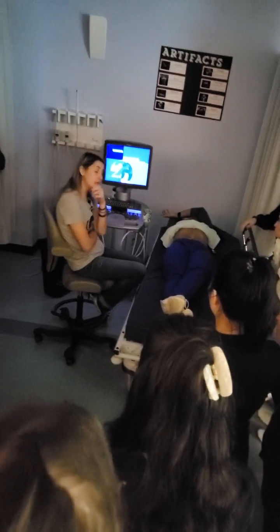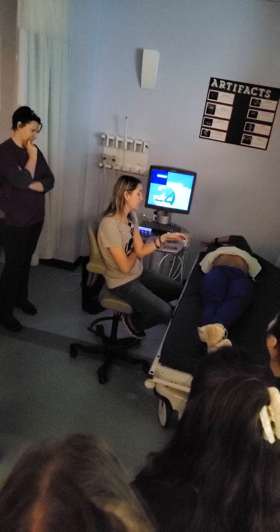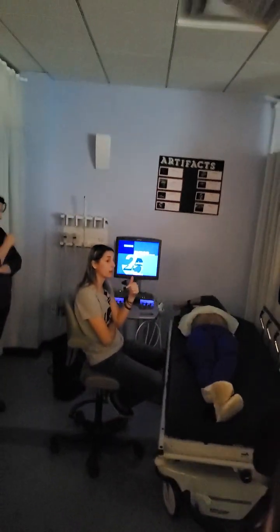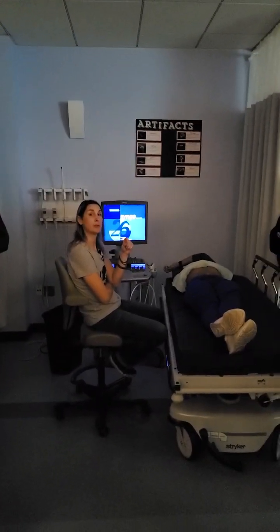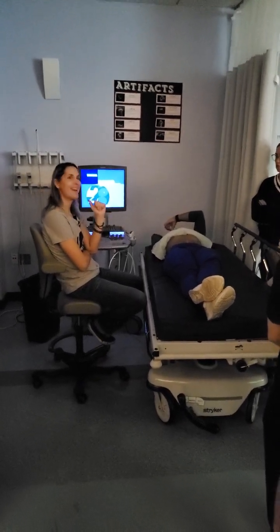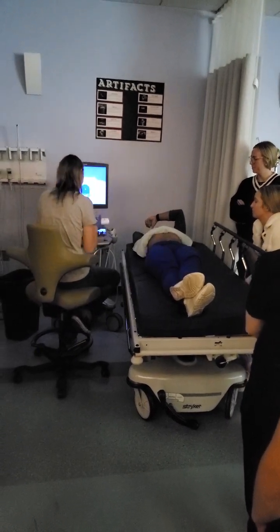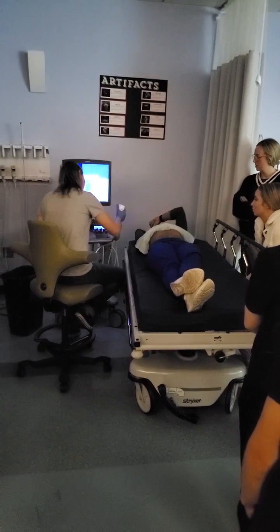CBDs, ideally, we want to show them extended from the distal portion at the head of the pancreas all the way to the common hepatic if we can. You guys are just going to worry about finding a little piece that looks like CBD. And how do we prove that it's CBD and not hepatic artery? With color. You got it. Smart. It's almost like you've been studying. Come on, really? I thought you were going to.